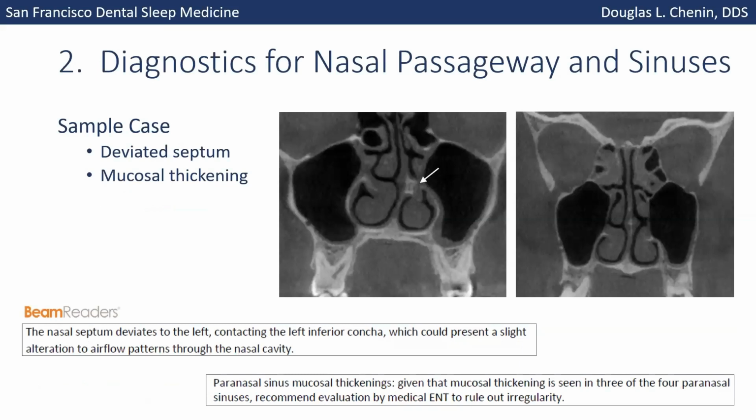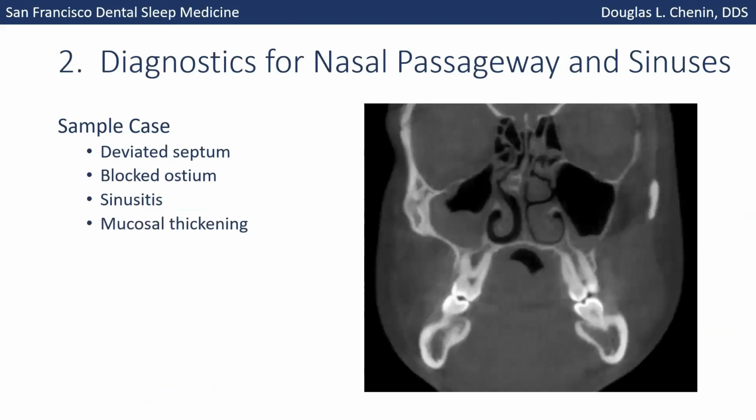We see a lot of deviated septums and just thin nasal passageways. This one, actually, you can see it kind of kinking off to the right on the left on the X-ray, but right for our view. And then another one, a little deviated septum there, but really thin nasal passageways and big turbinate. Patient's left, but our right, that turbinate is enlarged, and that nasal passageway is really small. There's a nasal cycle, so it goes left to right, so they'll be kind of bigger and smaller, but that's way too small on that small side of the cycle.